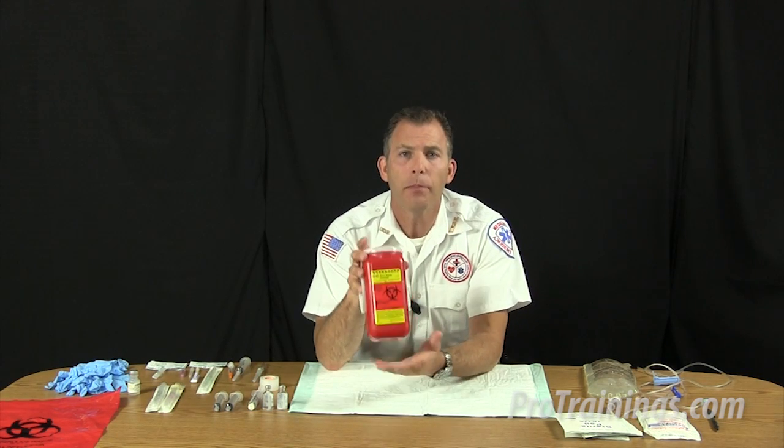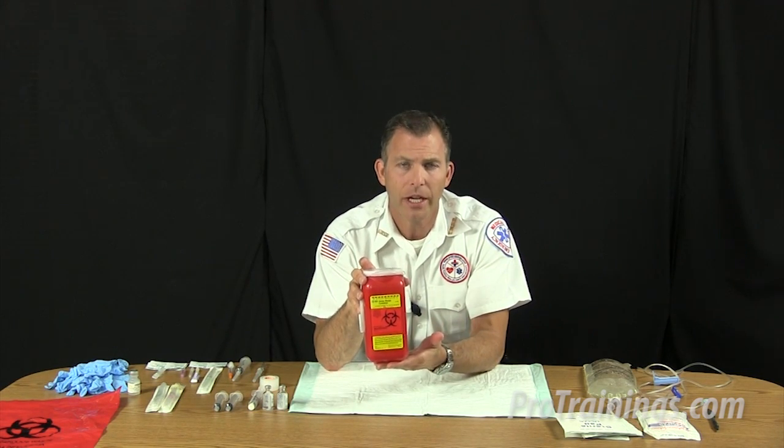Needles and other sharps must be discarded in leak-proof, rigid, puncture-resistant containers. Sharps with engineered sharps injury protections are defined as a non-needle sharp or a needle device used for withdrawing blood or body fluids, accessing a vein or artery, or administering medications or other fluids, with a built-in safety feature or mechanism that effectively reduces the risk of an exposure incident.